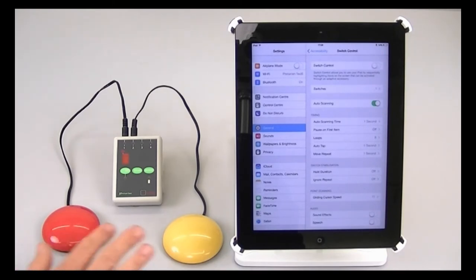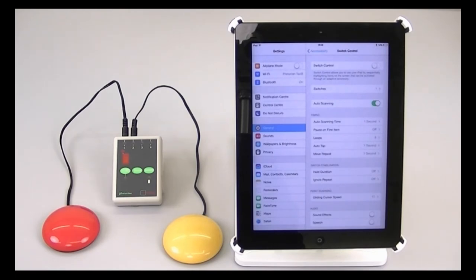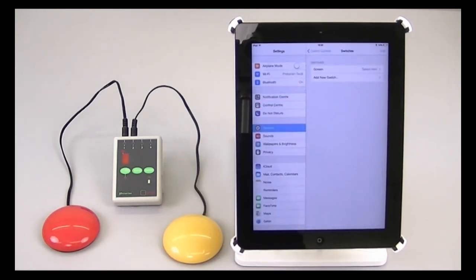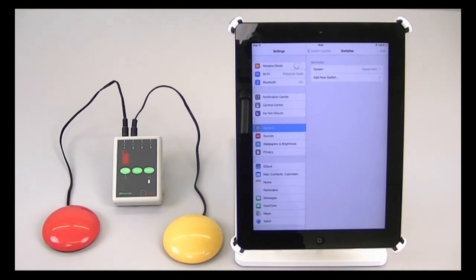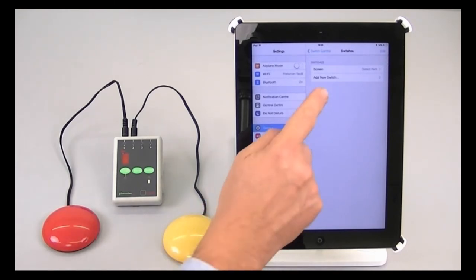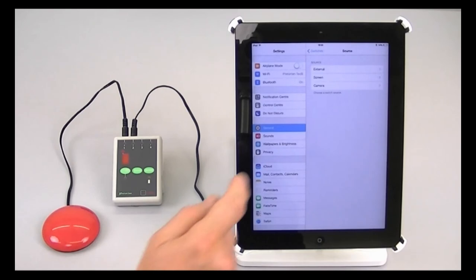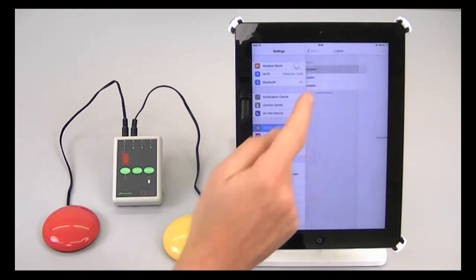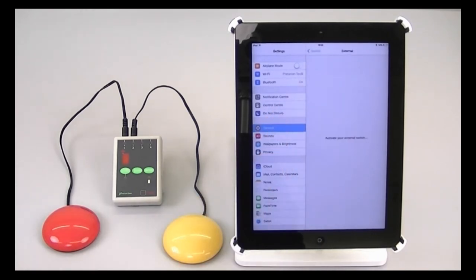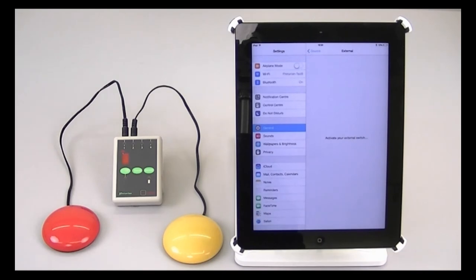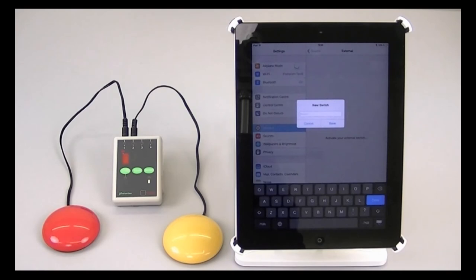To add these two switches to the functionality of switch control, I need to do them one at a time. First of all, let's tap on switches, and we'll add the red switch, which is going to be scan to next item. So I add a new switch, it's an external switch, which in this case means a Bluetooth switch. Now it's asking me to activate your external switch. So I'm going to tap the red switch, and it's now asking me for a name for that switch.